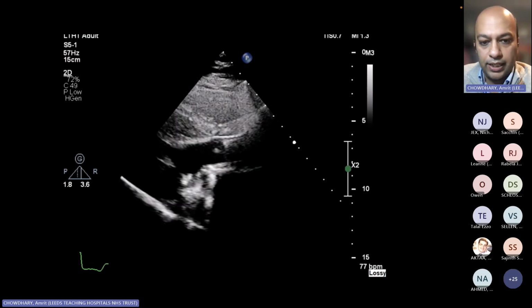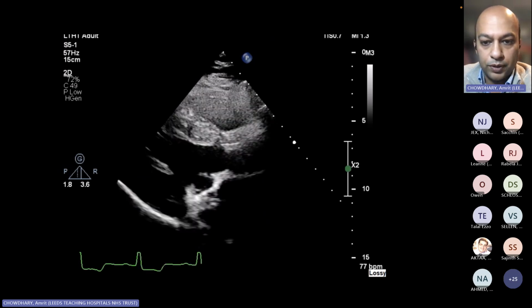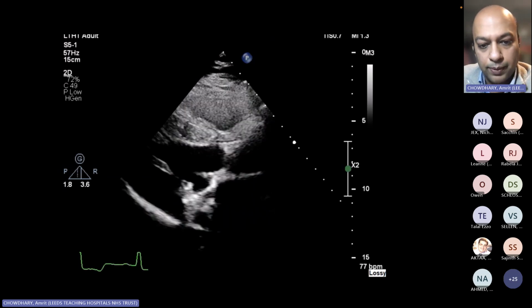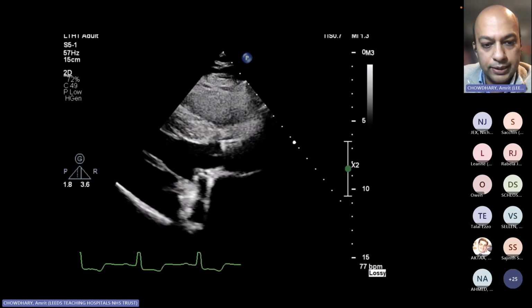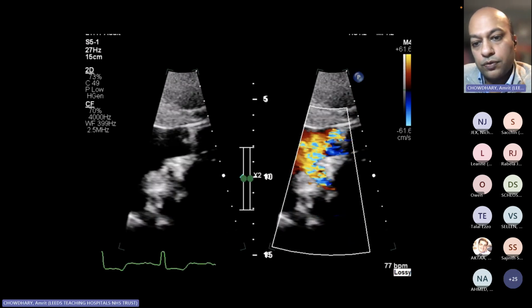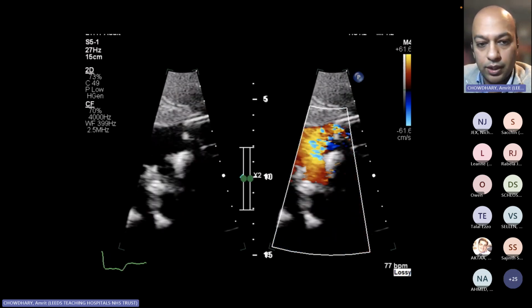He had a transthoracic echocardiogram, and I hope you can all see the videos properly. It does take a bit of time to start playing properly. I'll just go through all the images so you can have a proper look. This is the parasternal long axis. This is a view of the valves again with some color flow, so color compare.